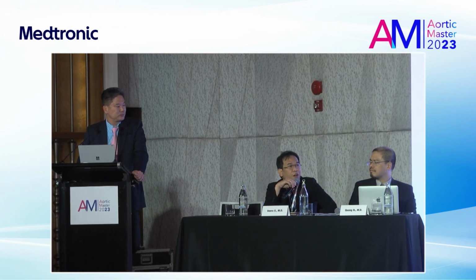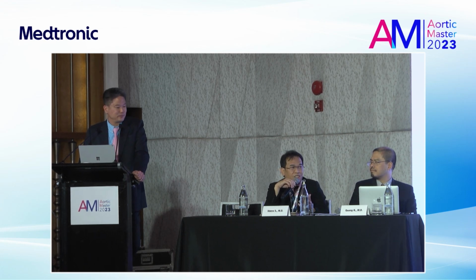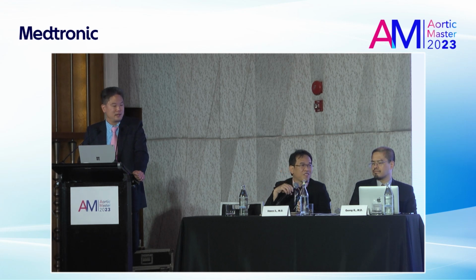I have one question. At the first operation, the patient presented with rupture and right iliac artery occlusion. Did the patient have any symptom before for the iliac occlusion? No, the patient was lost to follow-up. But in the rupture condition, I think only AUI without fem bypass is enough because the patient had no symptom of the iliac occlusion. That went through our mind too, but since everything was over there and the patient was stable, we decided to do a fem-fem crossover.